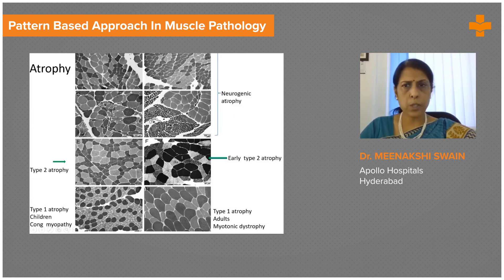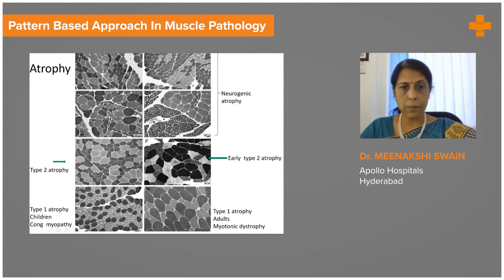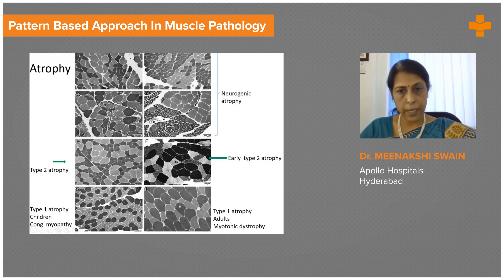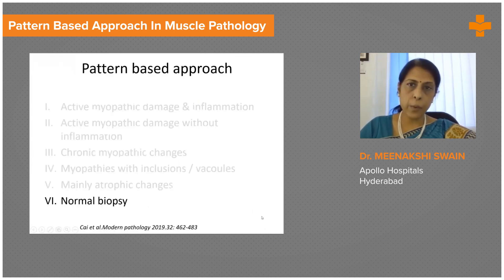The top two rows represent neurogenic atrophy, which I've already dealt with earlier. For type 2 atrophy in an adult, on an ATPase stain at pH 9.6, type 1 fibers are pale and type 2 are dark — the type 2 are distinctly smaller than type 1 fibers. Type 2 atrophy in adults is a fairly nonspecific finding, which could be seen due to disuse or steroid use. But in children, if you get atrophy of type 1 fibers — the light fibers — which are much smaller compared to type 2, then you're probably dealing with a congenital myopathy. Whereas in an adult patient with type 1 atrophy, you're probably dealing with myotonic dystrophy. So it's very important to carefully correlate with clinical findings and evaluate these enzyme stains to arrive at the right diagnosis.